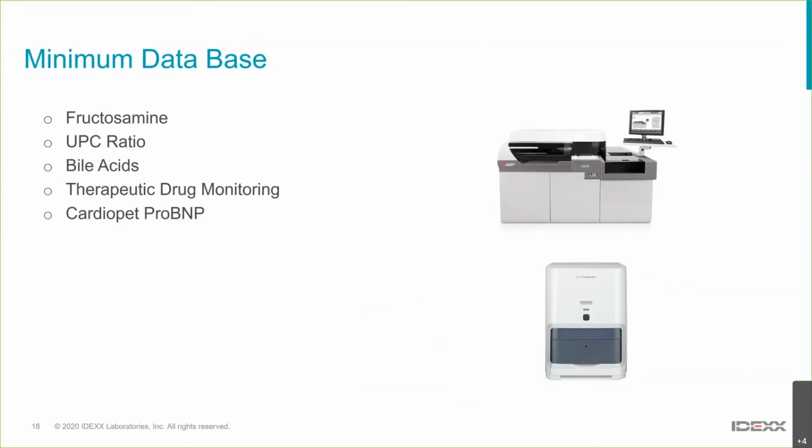Bile acids are not a test that we're going to do routinely on every patient that we're doing a biochemical profile on. But in ones where we've got consistent clinical signs, so a patient with neurologic signs, with seizures, a younger dog or cat that maybe has neurologic or GI signs or signs of urinary tract disease with things like ammonium urate crystals, or significantly elevated liver enzymes, we may deem that we need to measure bile acids. Can do that in the lab. Very soon we'll be able to do that in-house on the Catalyst.